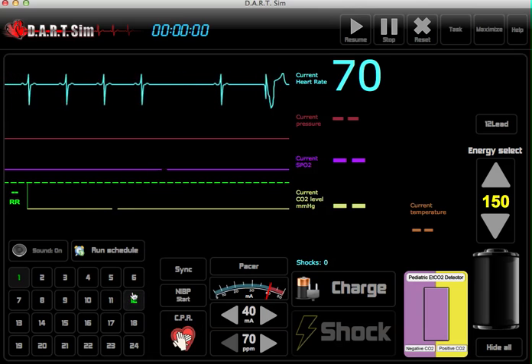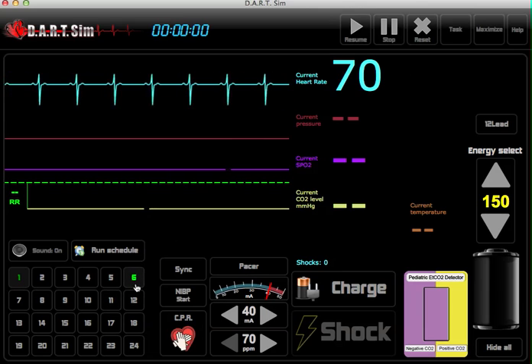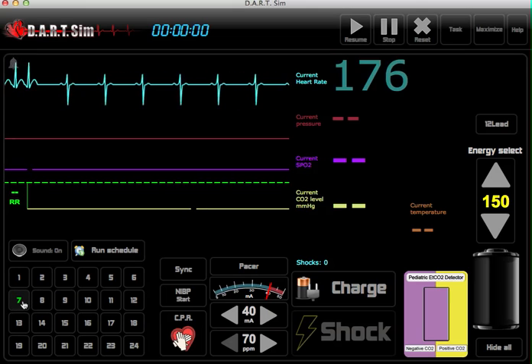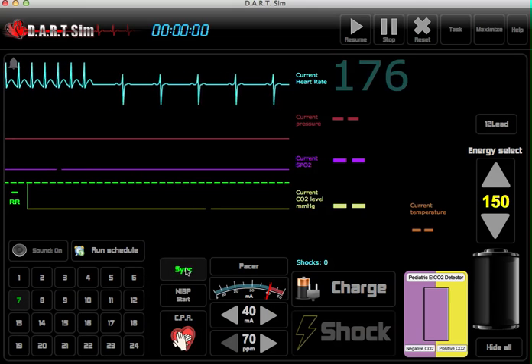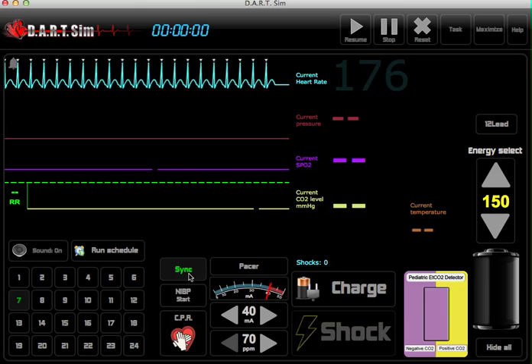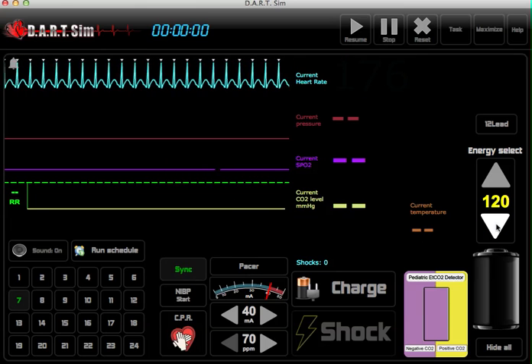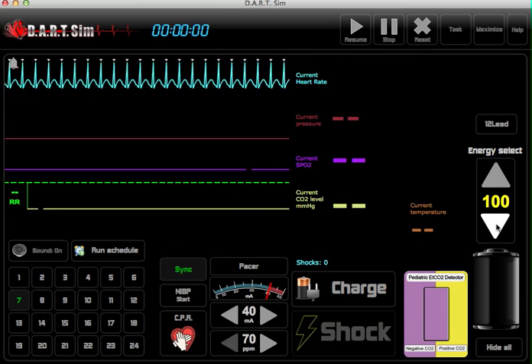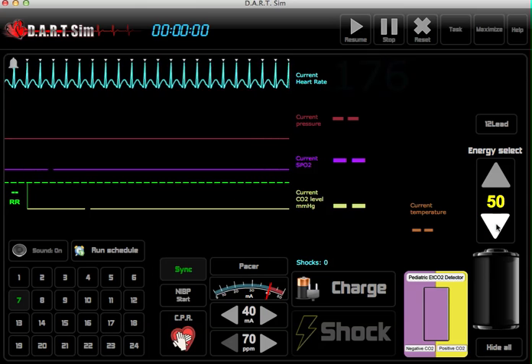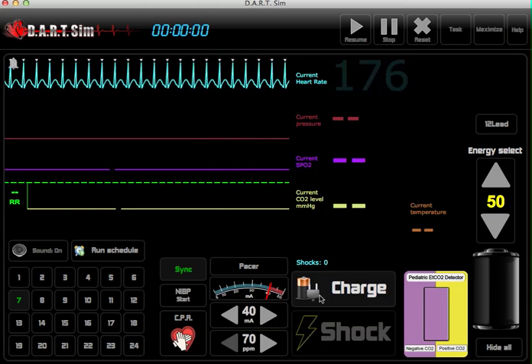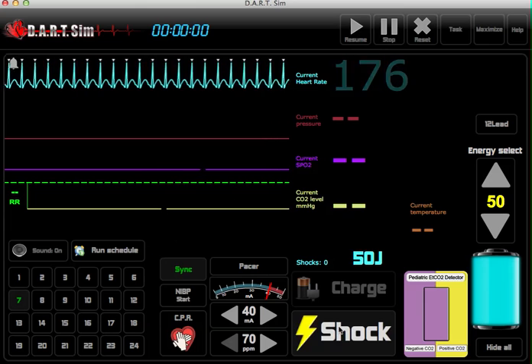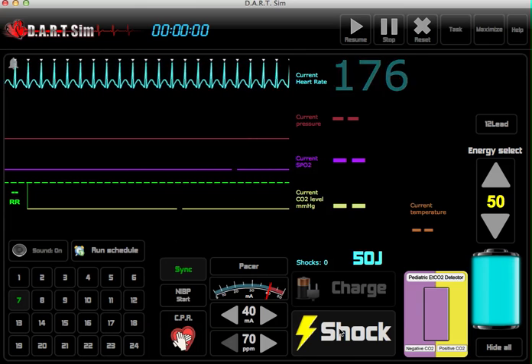We also have synchronized cardioversion. Simply tap on the sync button there and then you can select your joules here. You can charge and give a simulated shock.